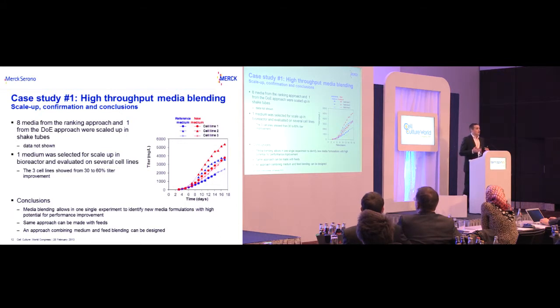We performed scale-up experiments and confirmation. First, we selected with the empirical approach, the ranking approach, 8 media, and also 1 from the prediction with the Design Expert approach.